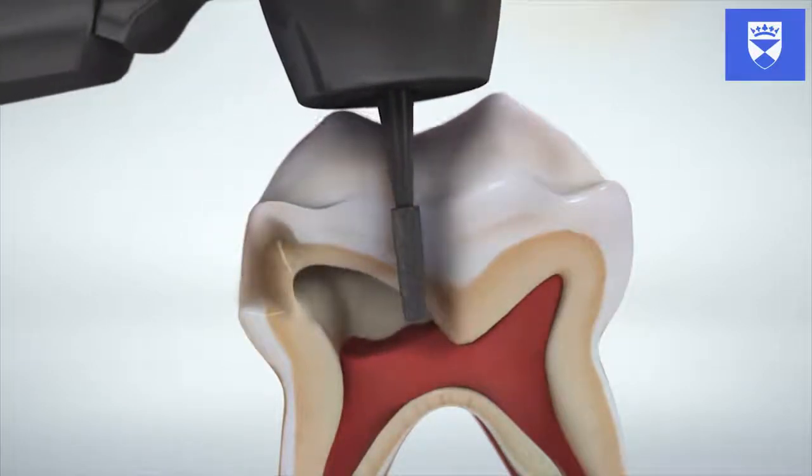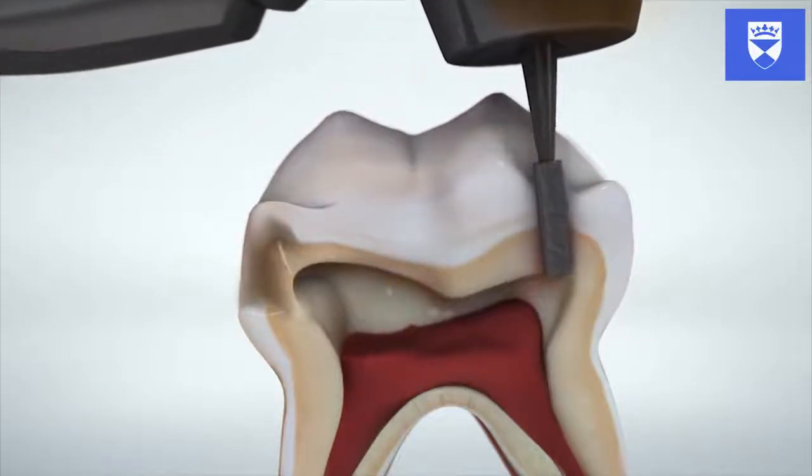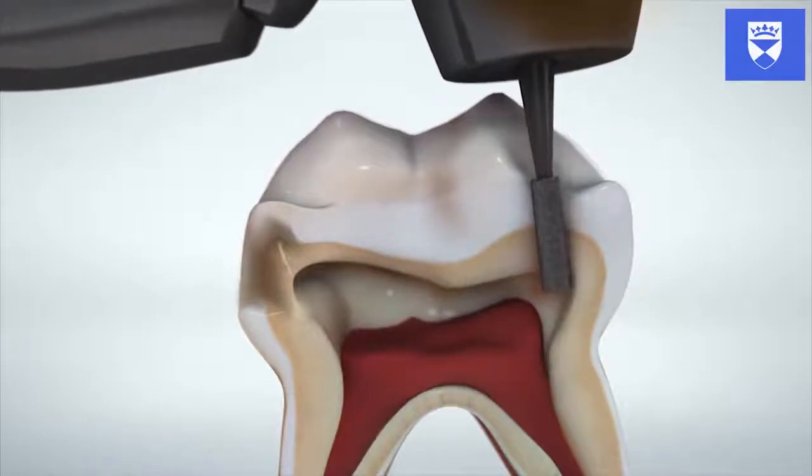At this point, you should observe bleeding from the pulp. If bleeding does not occur and the pulp appears necrotic, then it can be assumed that the pulp is non-vital and a pulpotomy would not be the appropriate course of treatment.